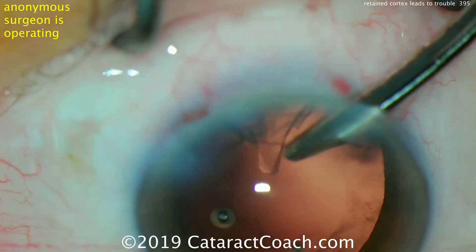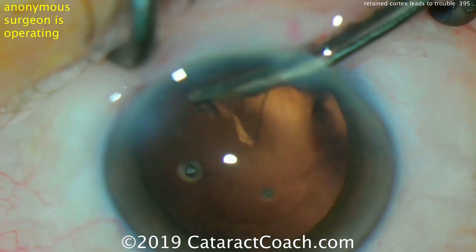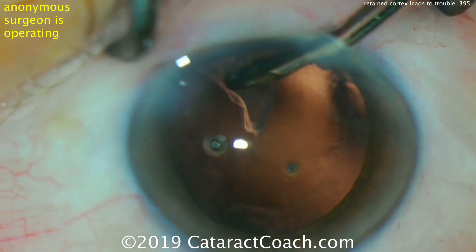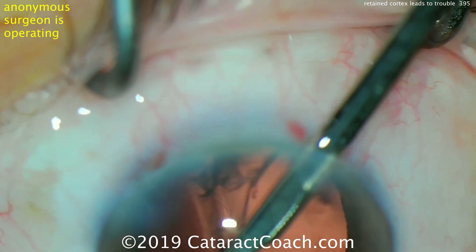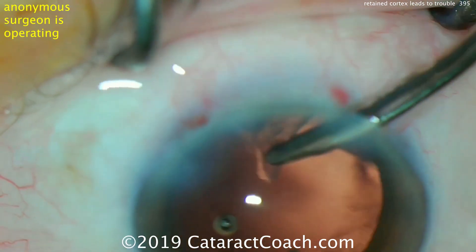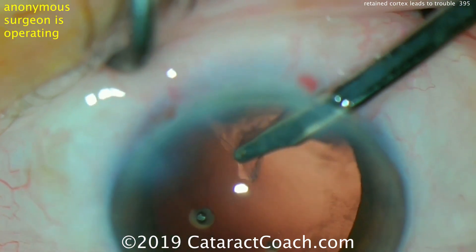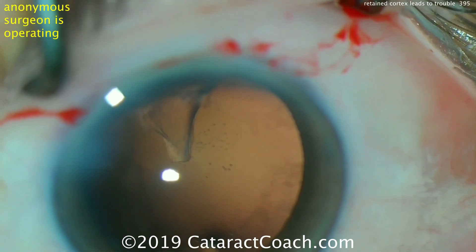Here we're removing most of the cortex, but there's still some stubborn cortex remaining. The best advice in cataract surgery is to clean up all the cortex and really clean up any residual lens epithelial cells adherent to the capsule bag. The cleaner we leave the eye, the less inflammatory response there is. Even then, we still use steroids and NSAIDs in the post-op period to quell any inflammation.